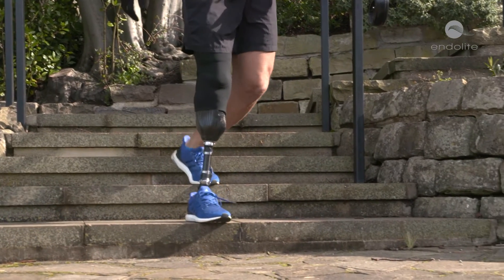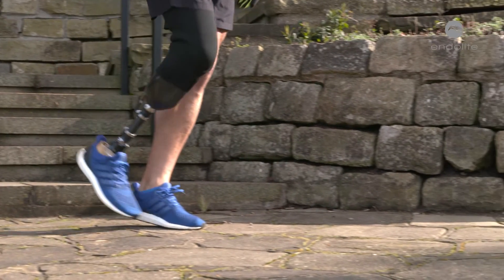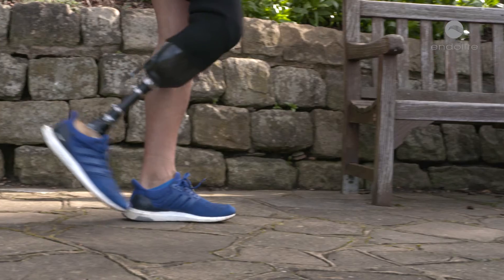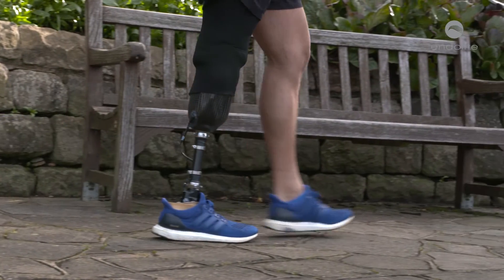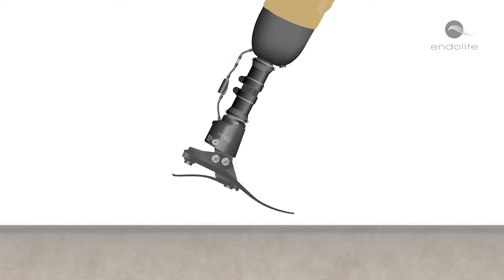The Echelon VAC is really good because it actually combines the features of an Echelon, which is a hydraulic ankle, and couples that with a vacuum system. So you get the best of both worlds — you get the advantages of both. The Echelon continuously self-aligns, adapting to different terrains, fine-tuning the ankle position for smoother, easier, and safer walking.